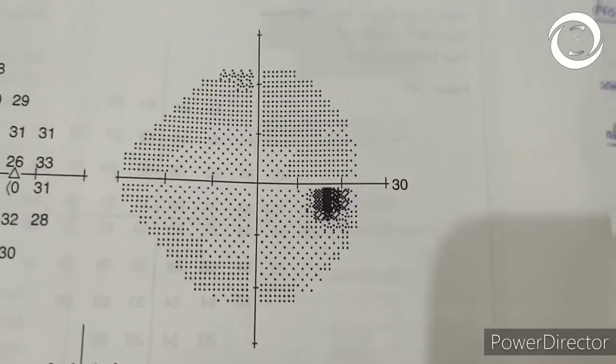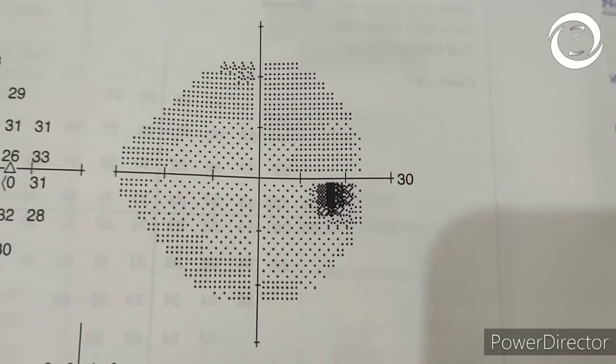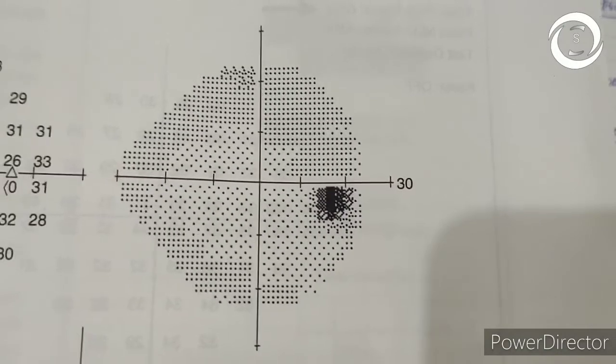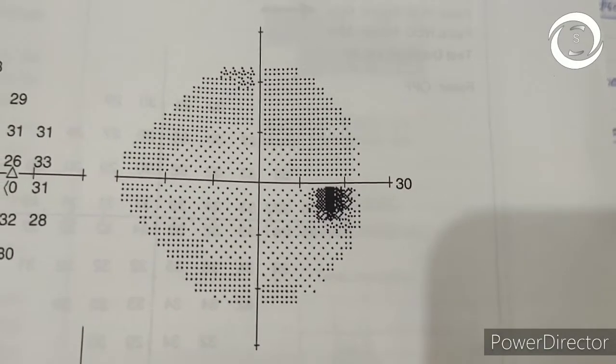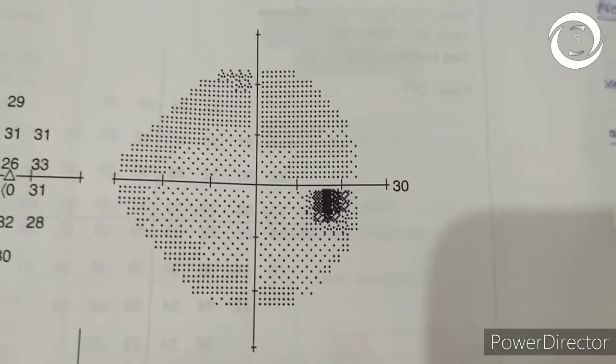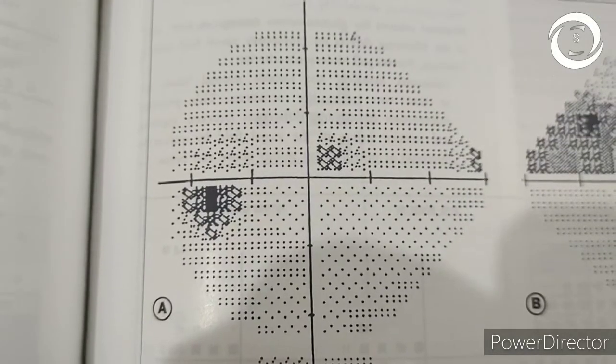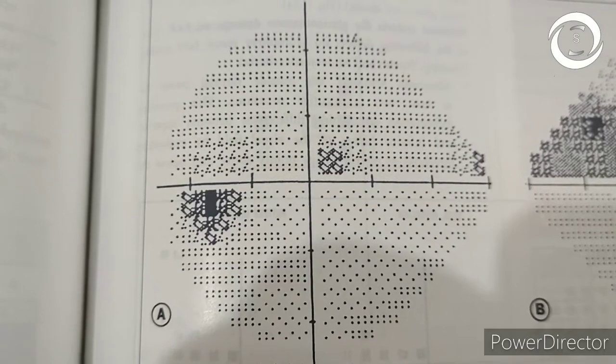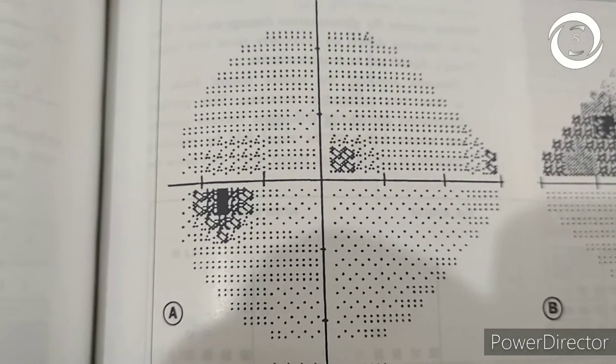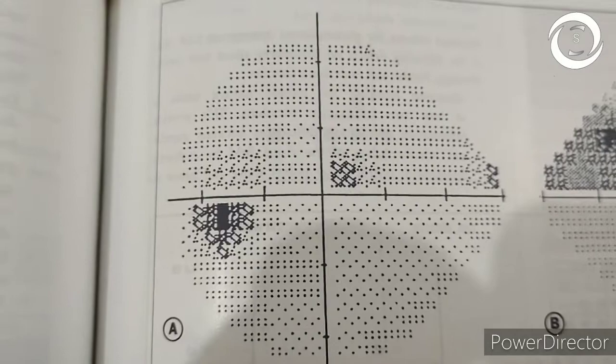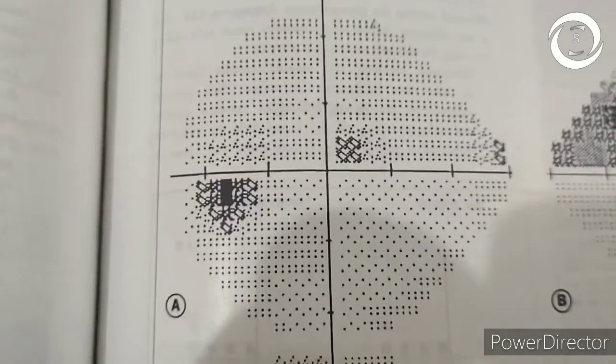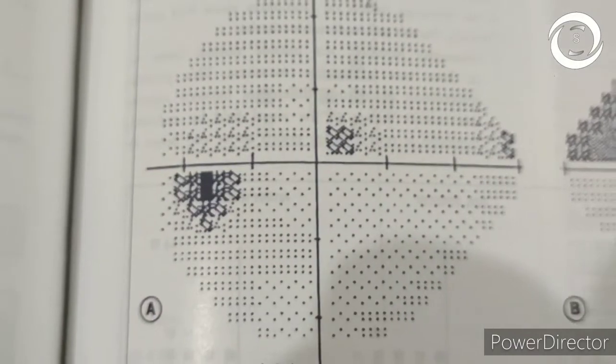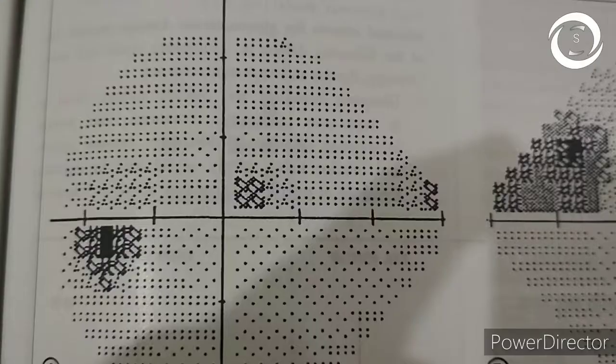The early specific glaucomatous field defects are paracentral scotomas, temporal wedge defect, and nasal step formation. First, look at the paracentral scotoma. Usually it is located in 10 to 20 degrees of visual fields, but here it is superior nasally closer to fixation because the patient had normal tension glaucoma where defects are closer to fixation.